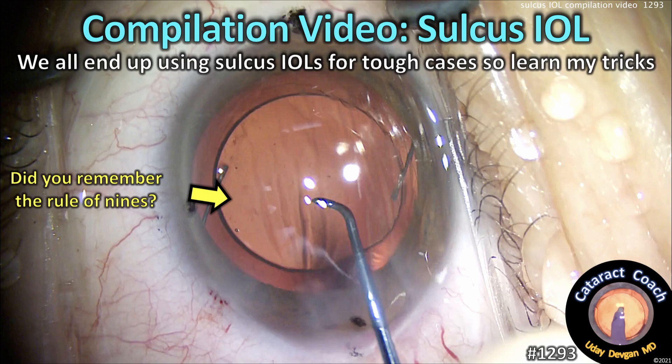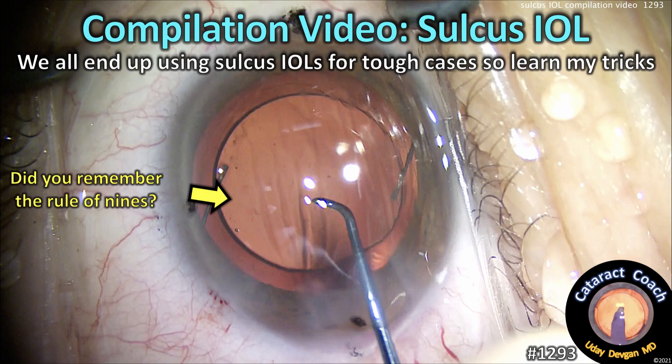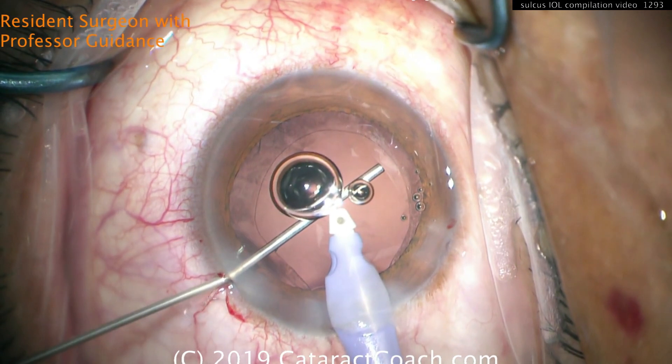Cataractcoach.com compilation video on the sulcus IOL. We all end up using sulcus IOLs for tough cases, so come on and learn my tricks here.